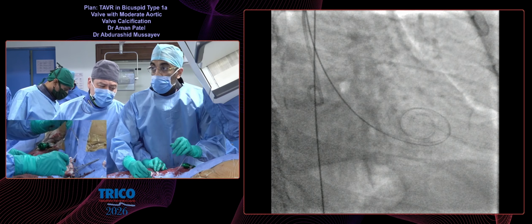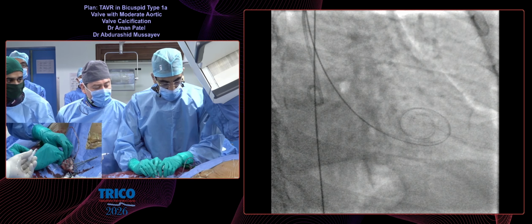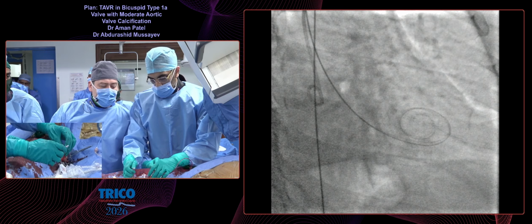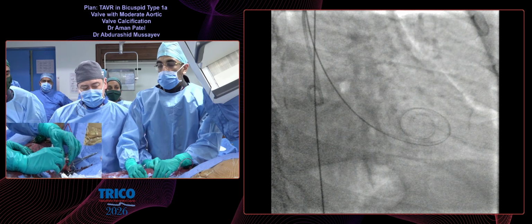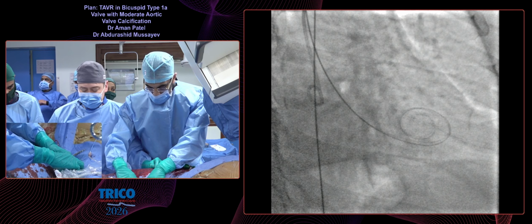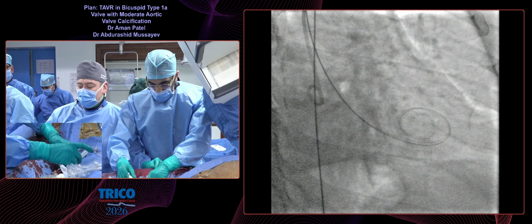Unfortunately, this Python sheath sometimes bleeds, maybe due to the hemostatic valve. Edwards also has an additional sheath for the transapical approach, as I remember, the Ascendra sheath. Very good. We also sometimes do transapical cases. Both of them are good and both of them work. But as I know, they did some upgrades of the Python sheath, and the next generation of the Python sheath will maybe look like the E-sheath.